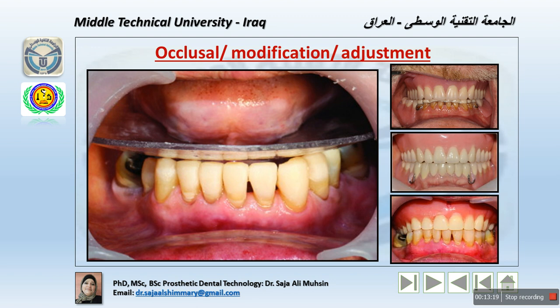Now, the metal template is placed on the incisal and occlusal surfaces of the lower stone cast teeth. The cusps and incisal edges which are too high or too low are identified. Then the high stone cusps are reduced with a sharp knife until there is an even contact of all teeth to the curved occlusal plane template.